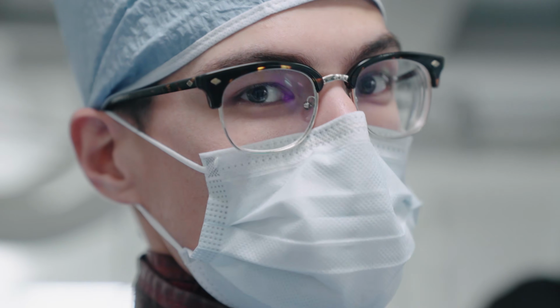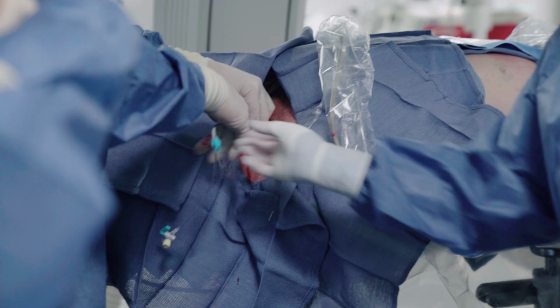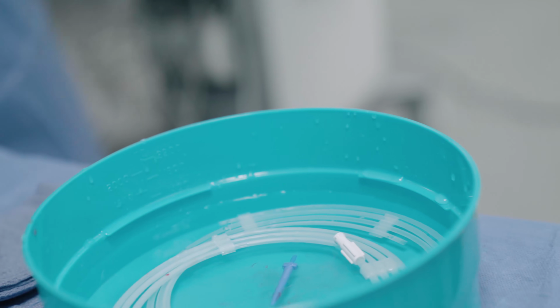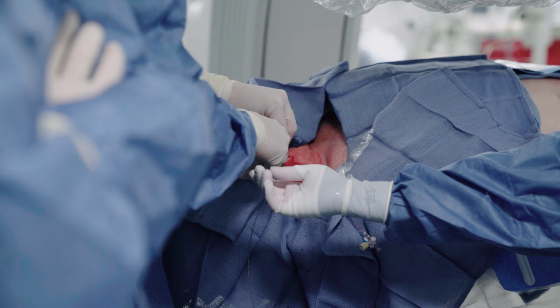So wire access is down through the heart, and we're down in the IVC, which is next to the liver. And we place our sheath. We've got a sheath access down. We're going to put another access point next to it, with another sheath. That's going to be for our IVUS catheter so we can see inside with ultrasound.